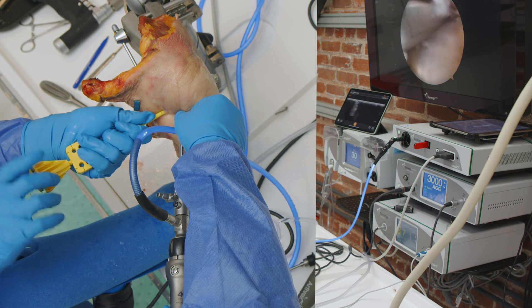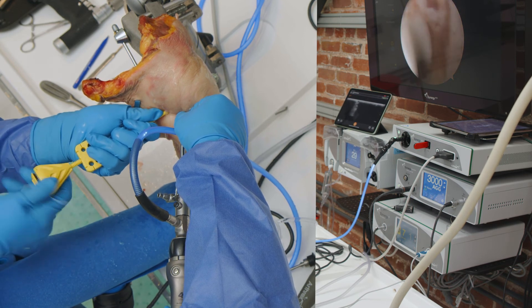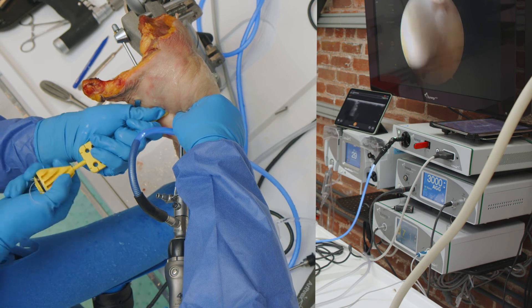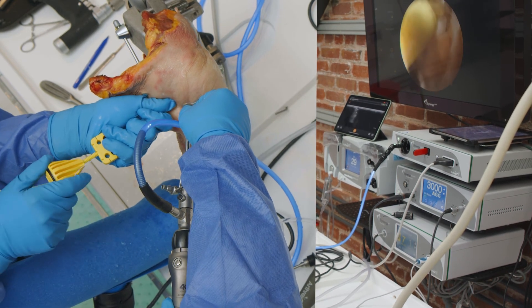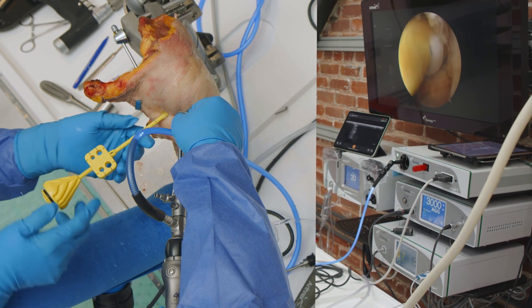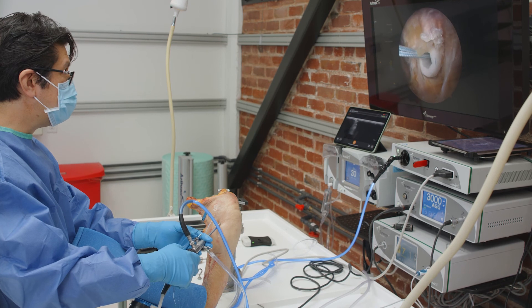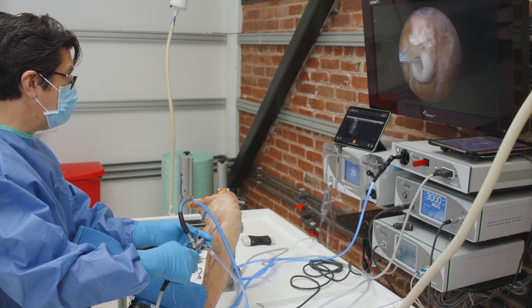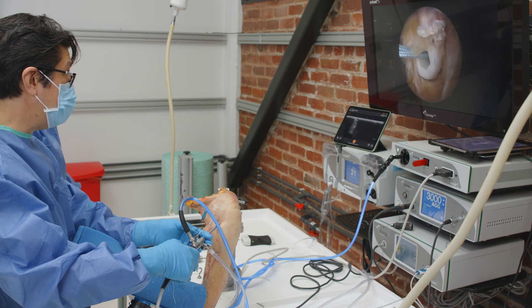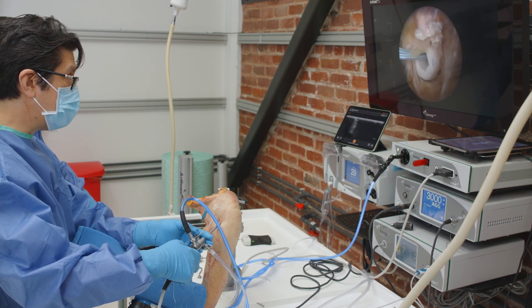I'm just going to screw the screw into the hole to tenodesis the biceps into the humerus. You can see that the biceps is tenodesis into the hole there. This was something that could only be done with ultrasound — to be able to identify where it was, and to fall in so quickly and easily to find it.